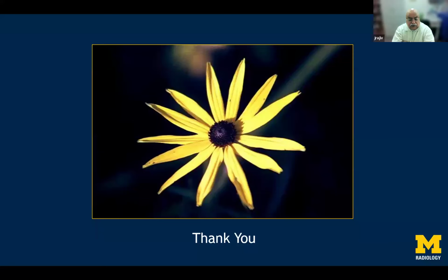In fact, the sinonasal tumor itself is a separate lecture, an entity altogether. There are guidelines available from the AJCC, the eighth edition, where you can make the diagnosis reasonably. As far as sinonasal malignancies go, the only challenge is in nasopharyngeal associated disease.